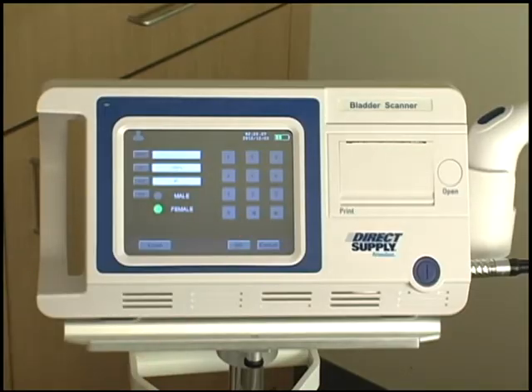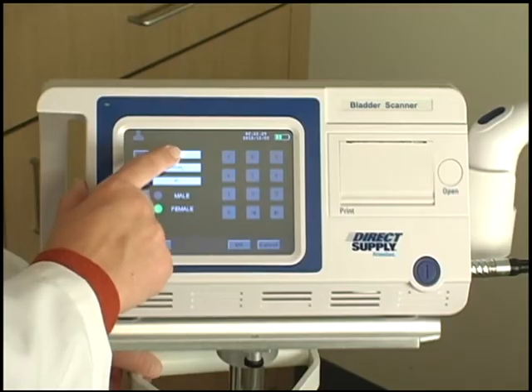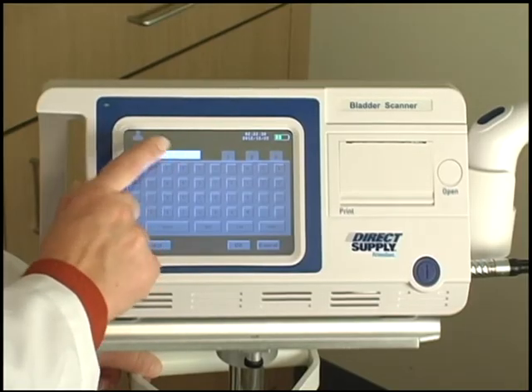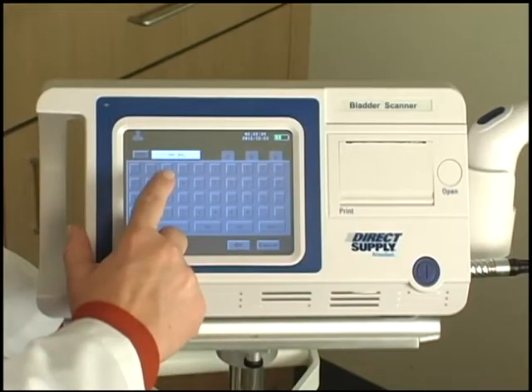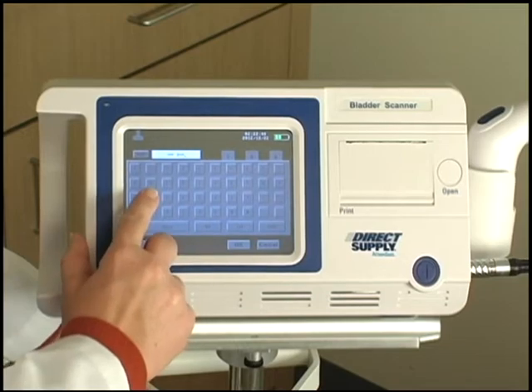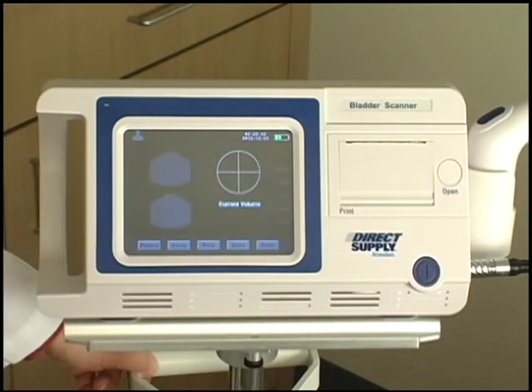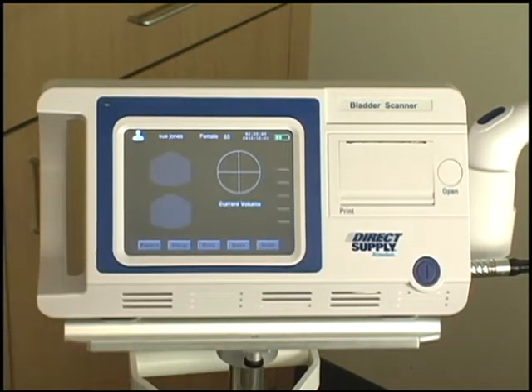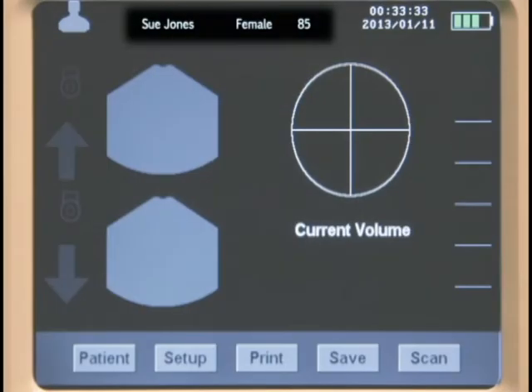To enter a patient's name, select the name data field. This will bring up a touchscreen keyboard. Once you have entered a patient's name, press the OK button. This will return you to the main screen. The resident's information will now appear at the top of the screen.